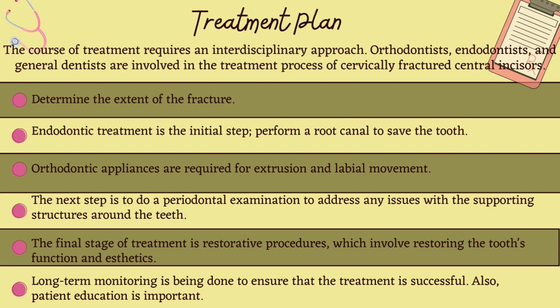Orthodontists, endodontists, and general dentists are involved in the treatment process of cervically fractured central incisors. Determine the extent of the fracture. Endodontic treatment is the initial step. Perform a root canal to save the tooth. Orthodontic appliances are required for extrusion and labial movement.